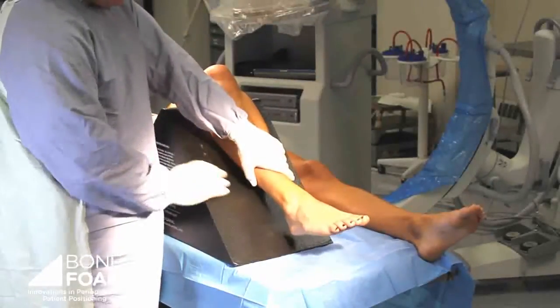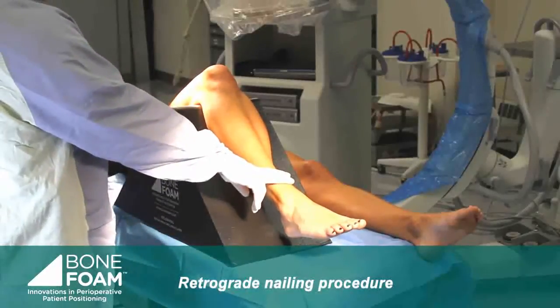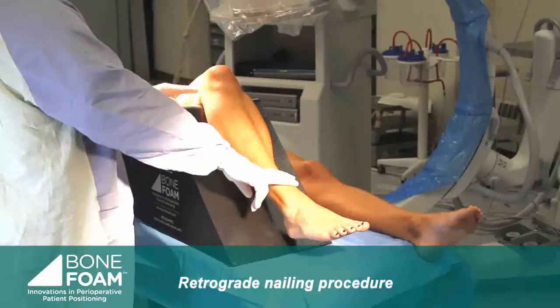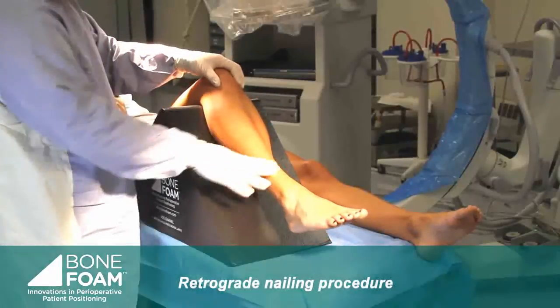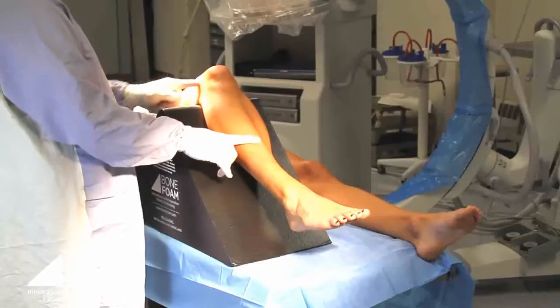Now this is what we call the obtuse triangle, and I use this for retrograde because this is the angle that the knee needs to be at to pass a guide wire down the femoral canal, the reamer, and the rest of the instrumentation. So this angle, the obtuse wedge, is designed for retrograde femoral nailing procedures.